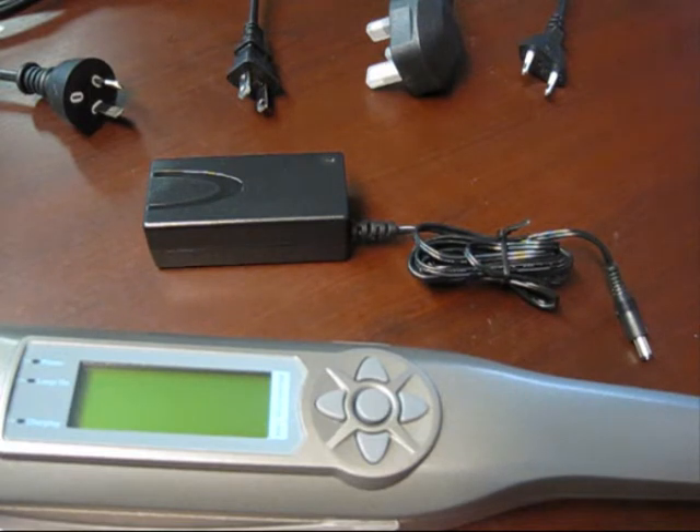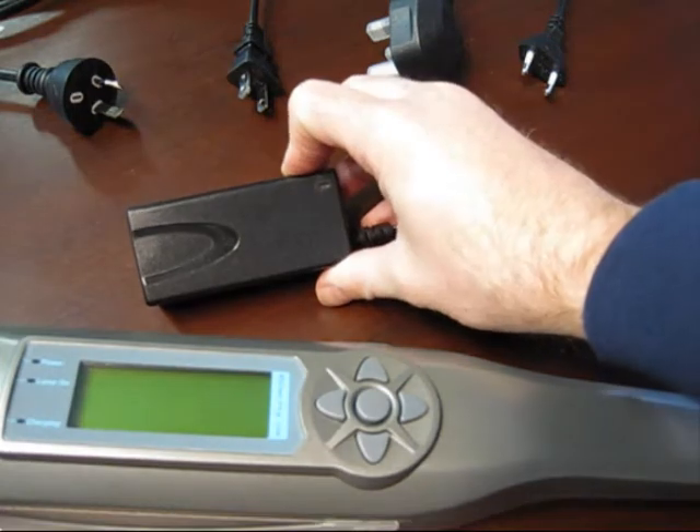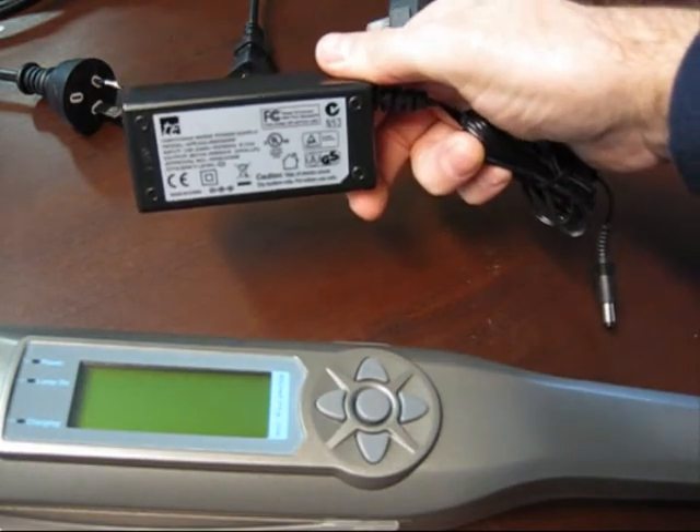Dermaray comes with everything needed to get it up and running. It comes with a universal power transformer. You can use this transformer safely anywhere in the world — it has all the appropriate electrical approval ratings.